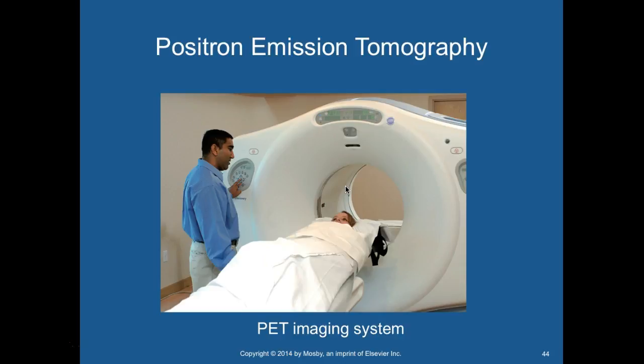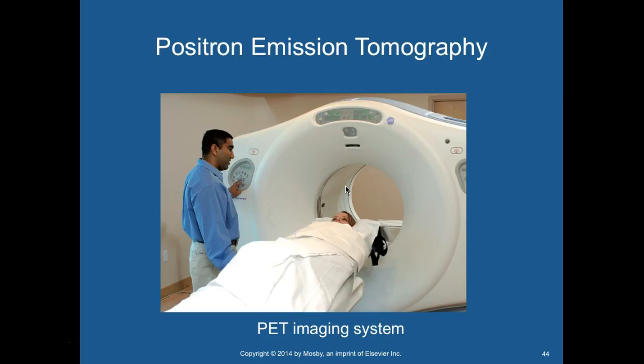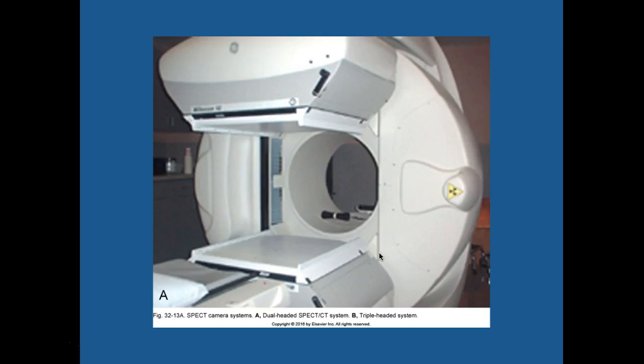Okay, positron emission tomography uses a radioactive nuclei injected into the patient. Then they go under a gamma camera, and then they get scanned in CT, and it has the same fusion imaging as this here. Typically this is a hybrid unit, I can tell by looking at it. In here is the gamma camera, and I think it's dual head as I recall. And then it has a CT scanner here in the front. So we stick them into the gamma camera for about 45 minutes to an hour, and then we scan them in CT, and then the software merges the two on top of each other.